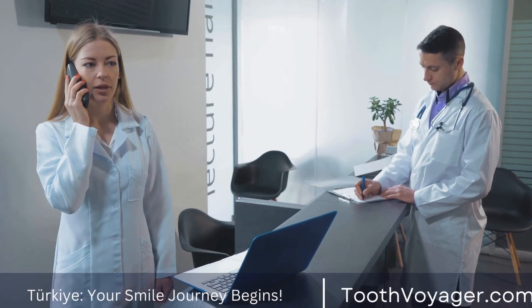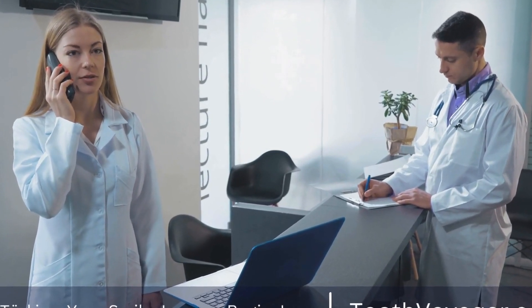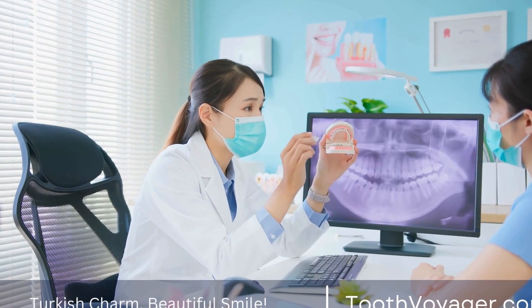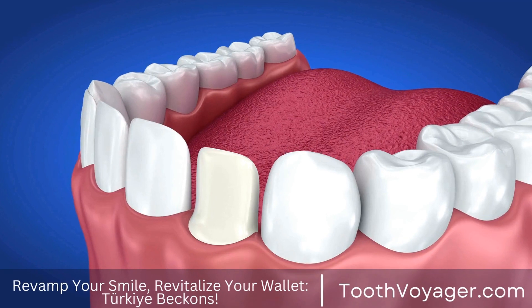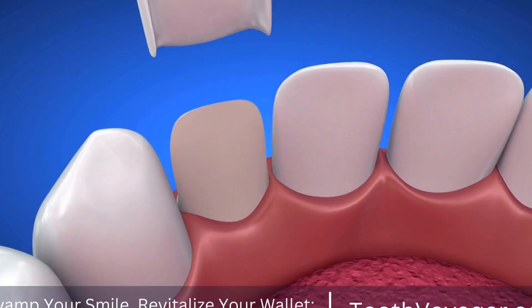After the crown is placed, the dentist will make any final adjustments to ensure a comfortable fit. This may include polishing the crown to match the natural luster of the surrounding teeth. The result is a functional and aesthetically pleasing restoration that looks and functions just like a natural tooth.